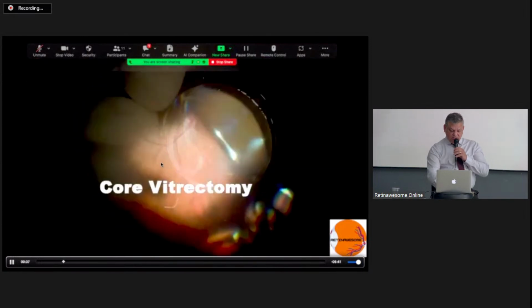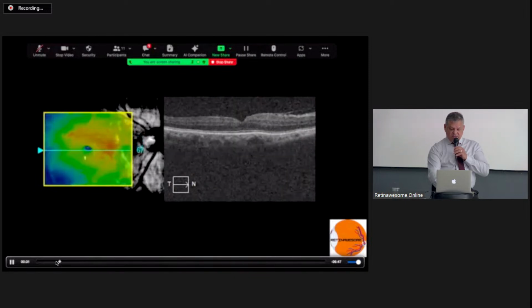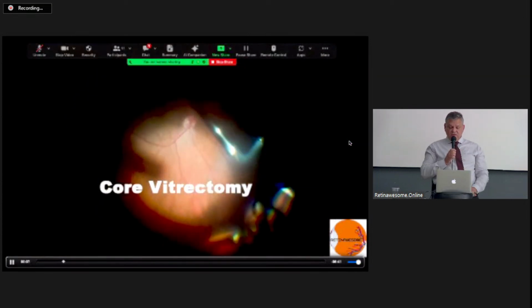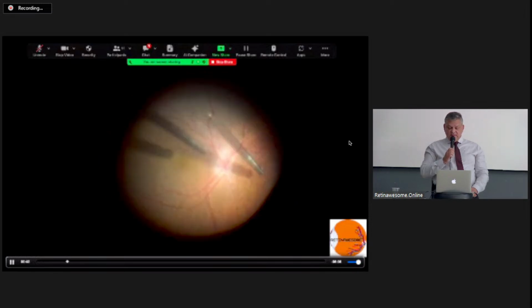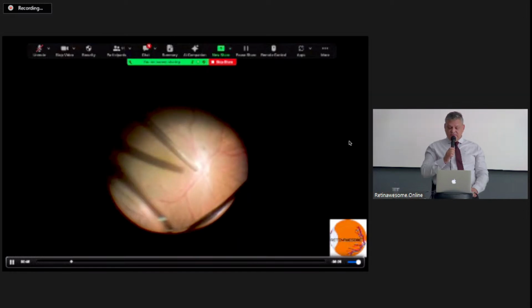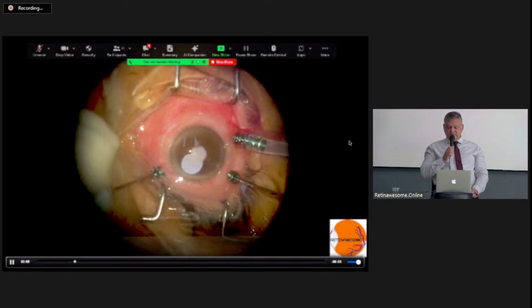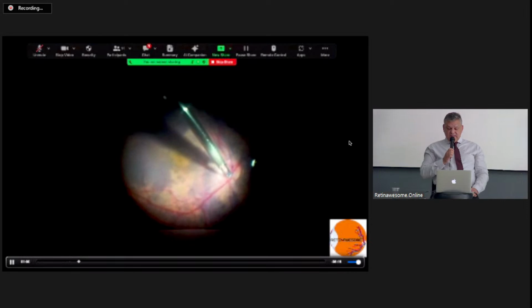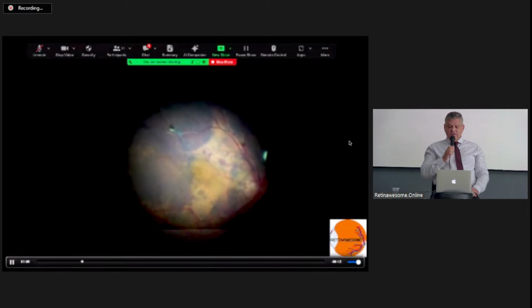I'm going to show you again here. You see it's a pseudomacular hole with epiretinal membrane, and how tiny the pupil is and how good the imaging is. So would you operate those cases with such a small pupil, or are you better off doing the cataract surgery before? You see how you've got some cataract here, irregular pupil due to uveitis, but still there is good dilation, enough dilation so that you could see what you are doing.